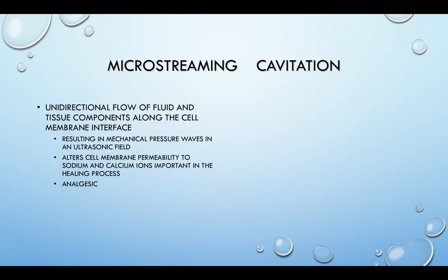ultrasound. So microstreaming or acoustic streaming is this unidirectional flow of fluid and tissue components as it flows over the cell membrane interface, okay? And again, both of these things, microstreaming, acoustical streaming, and cavitation, are all interrelated to each other, okay? And again, if we have them at a high duty cycle, high intensity, these will result in heat, okay?